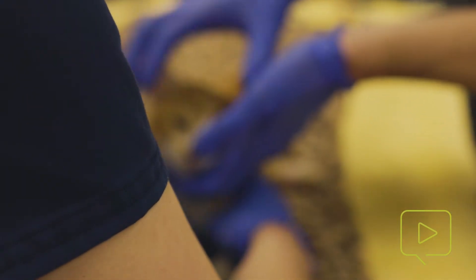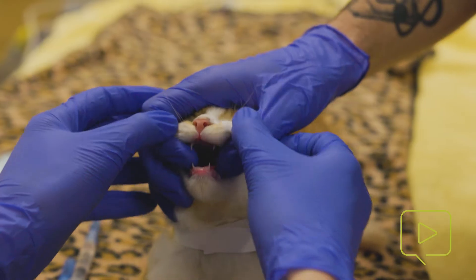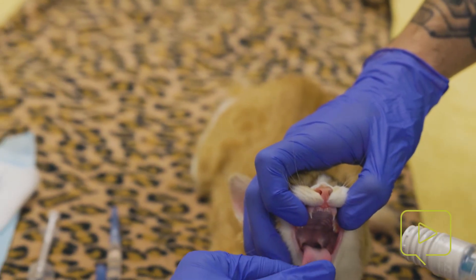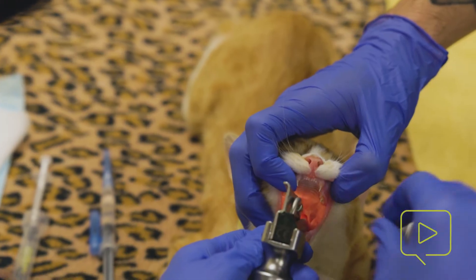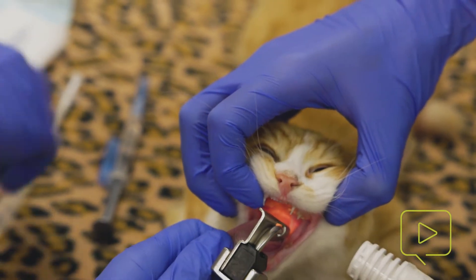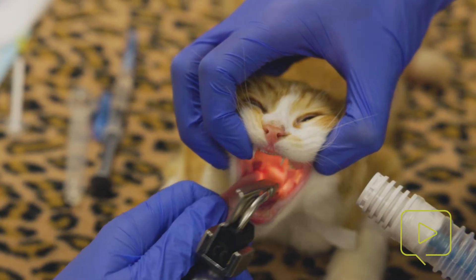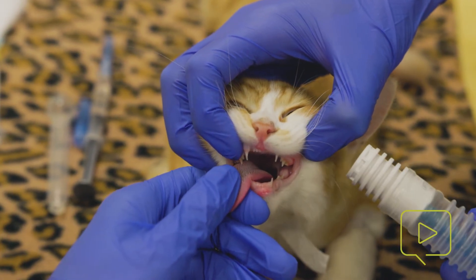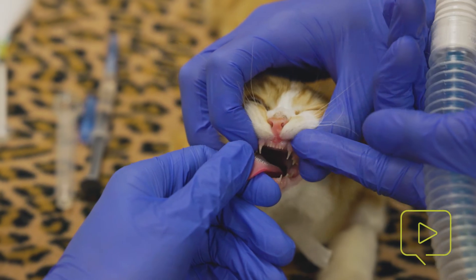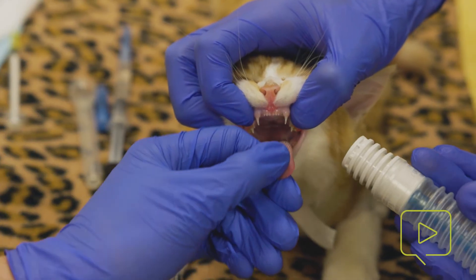Zach's going to sit him up in a neutral position — this is going to be the easiest way to intubate any pet, but especially with cats. We'll take the tongue, pull it out of his mouth and down to get really good visualization. I use my laryngoscope to take a peek down here and I'm going to have Zach tilt his head down so you can get some nice visualization in the back of the mouth. I'm going to put our lidocaine in the back to help with some of those laryngeal spasms. Getting a little bit more propofol here as there's a little bit of a swallow reflex.